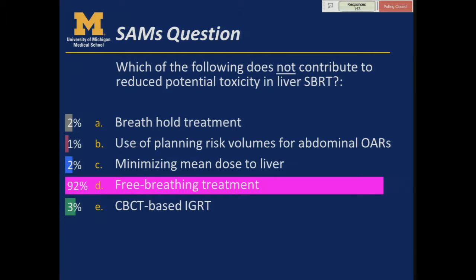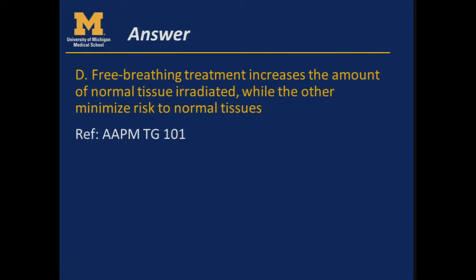All right. Excellent job. So of course, free breathing treatment will increase the amount of normal tissue irradiated, while the other answers would minimize risk to normal tissue.